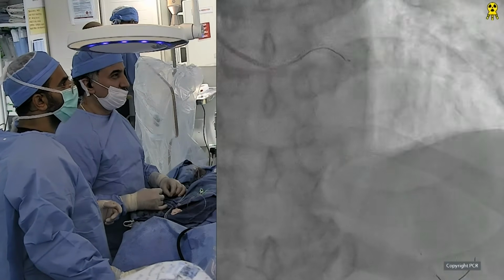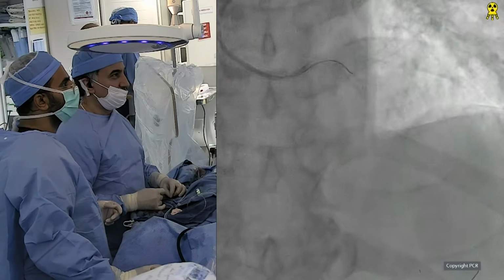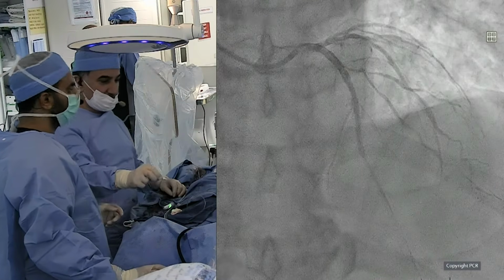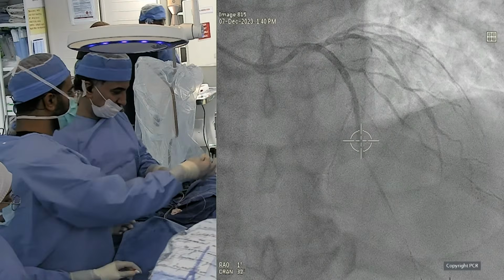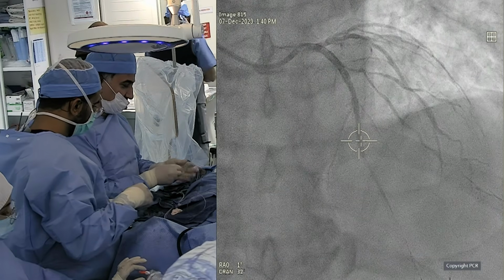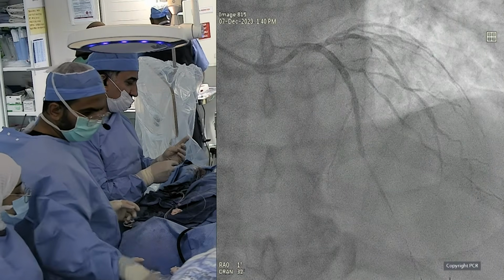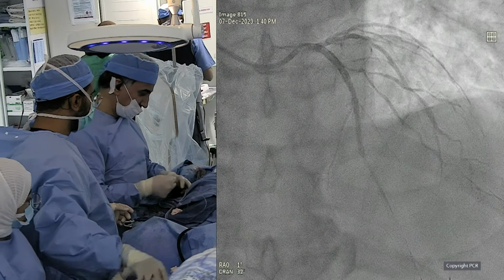In our studies, stenosis less than 90% and TIMI flow 3 is the indication not to proceed with kissing and opening. If the patient is stable, if the ECG is without changes, and we have TIMI 3 with residual stenosis less than 90%, that's in contemporary studies the indication to stop at that point.